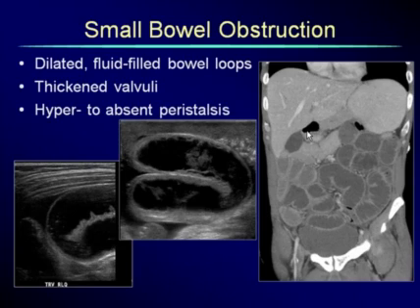There's hyperperistalsis, but it's not getting through. The fluid is backing up. All these secretions that are coming down from the mouth and stomach, etc., build up, and then the gas gets burped out or absorbed or passed, and the bowel continues to fill and fill with fluid. That's the kind of bowel that we're talking about here.